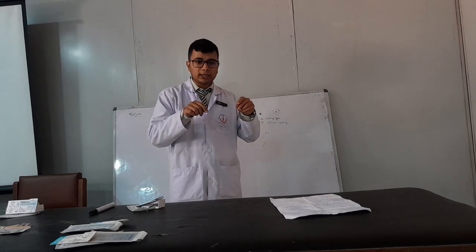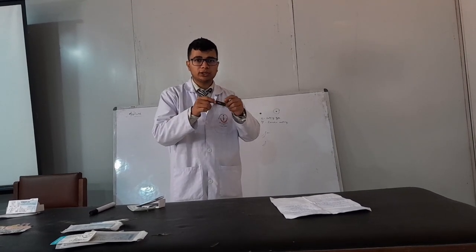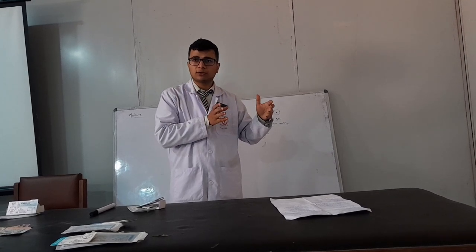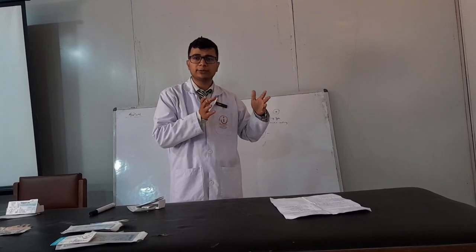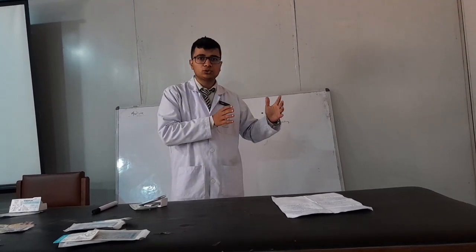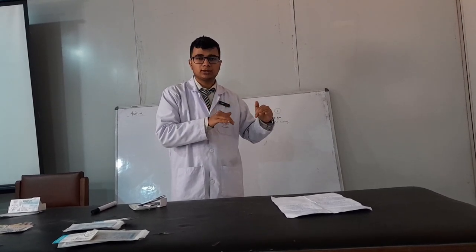So while making the knots, we need to tie the knot. Now you can think, if it is a smooth surface, will the knot be stable? Will it be easy to make a knot? No. So monofilament sutures will be difficult to make the knot.